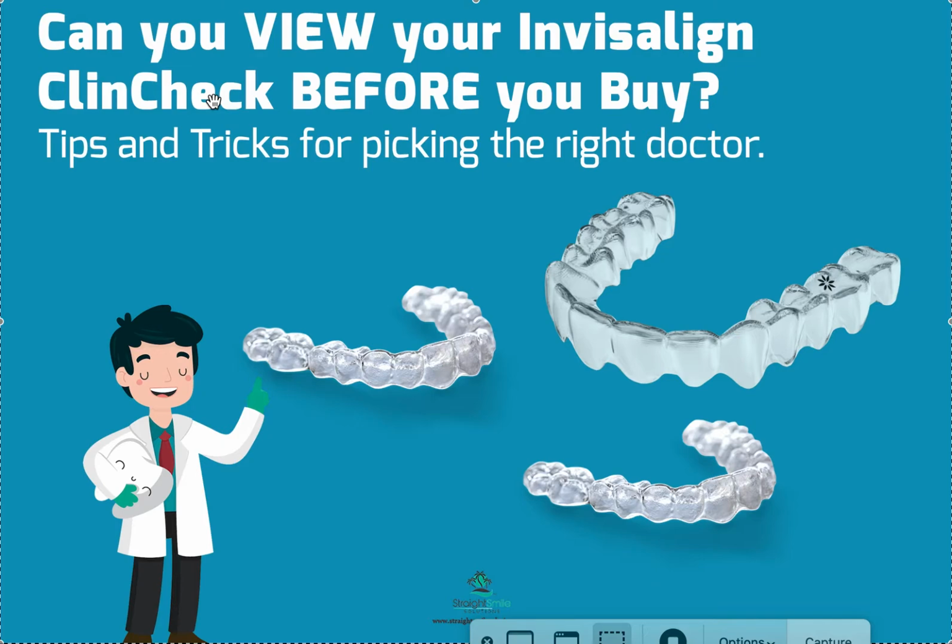So yes, I have videos. If your doctor does not know how to do this, it's very easy. I have a video on exactly how they can go about sending it to you. It's not as easy as you think, because of HIPAA compliance, which is a law in most countries. They have to go through a special two-step process where they email it to you and you get a password. It's not hard by any means, but it's something your doctor will have to do on their end. It'll come by email. You can view it then, play with it, manipulate it, and see how many stages it is.